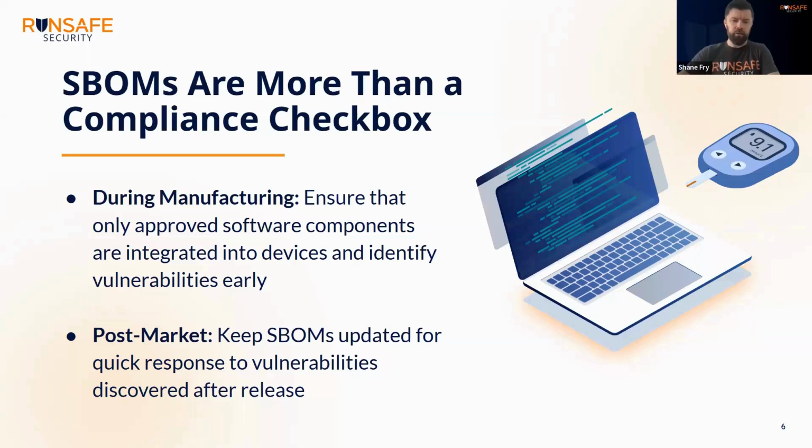Yeah, absolutely. And I like the way you simplified it. An SBOM is a list of components, and there's a lot that you can do with it, and you can get really mired in where you're generating your SBOM, or are you including build tools or not? And there's a lot of details that we can chat for hours about, but really what it comes down to is what's the software that's in your system.